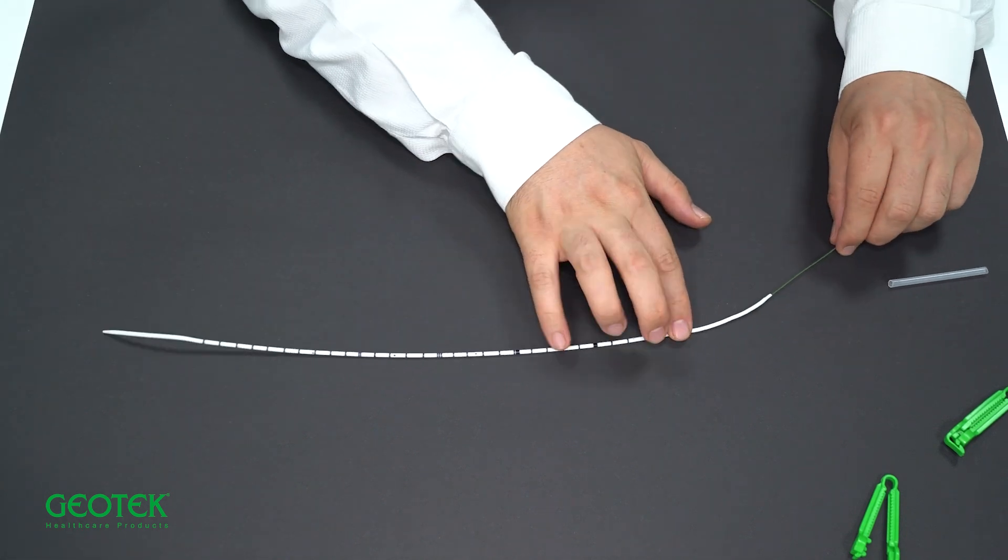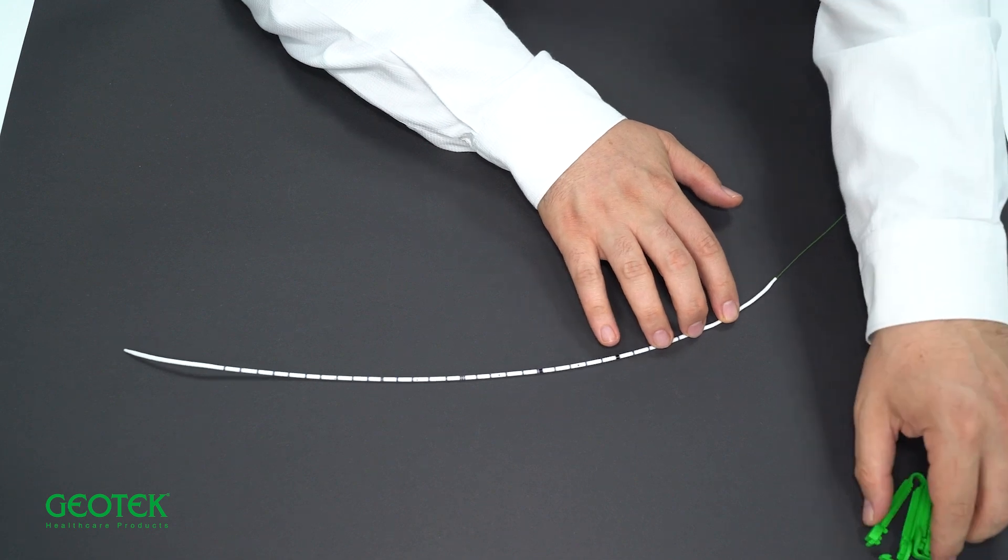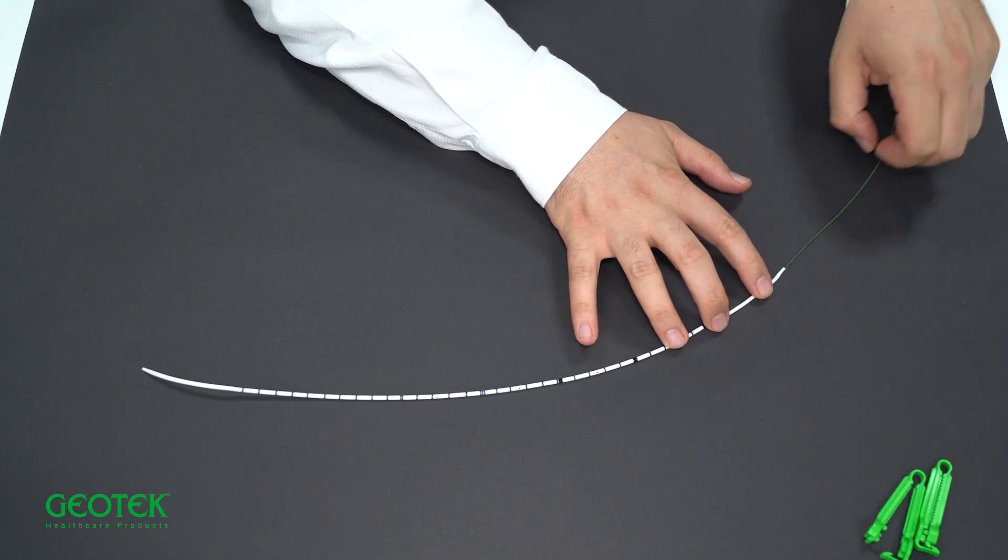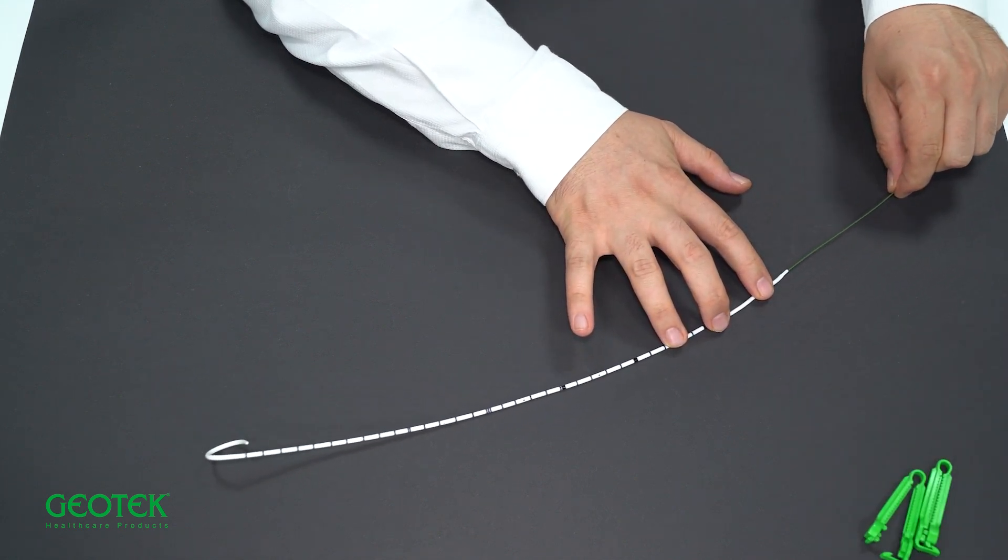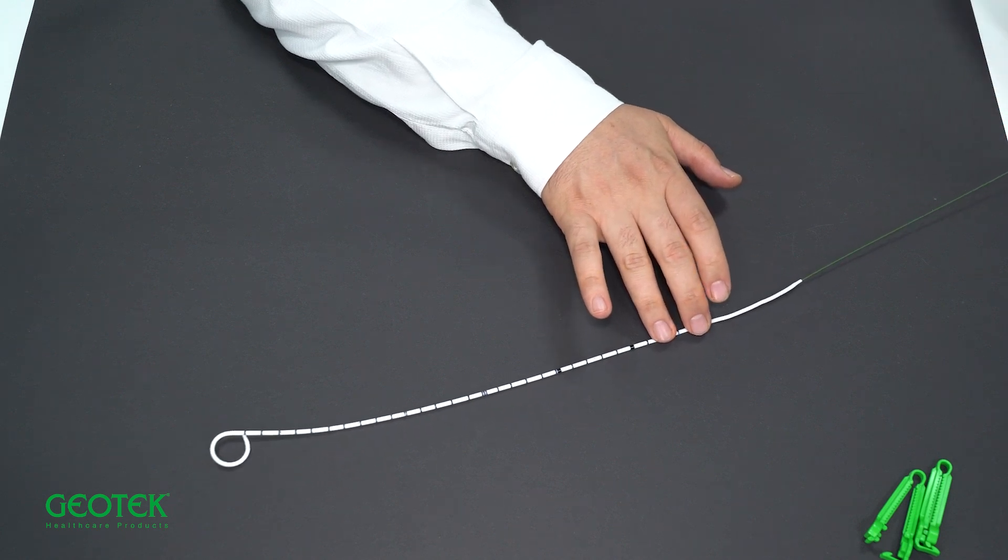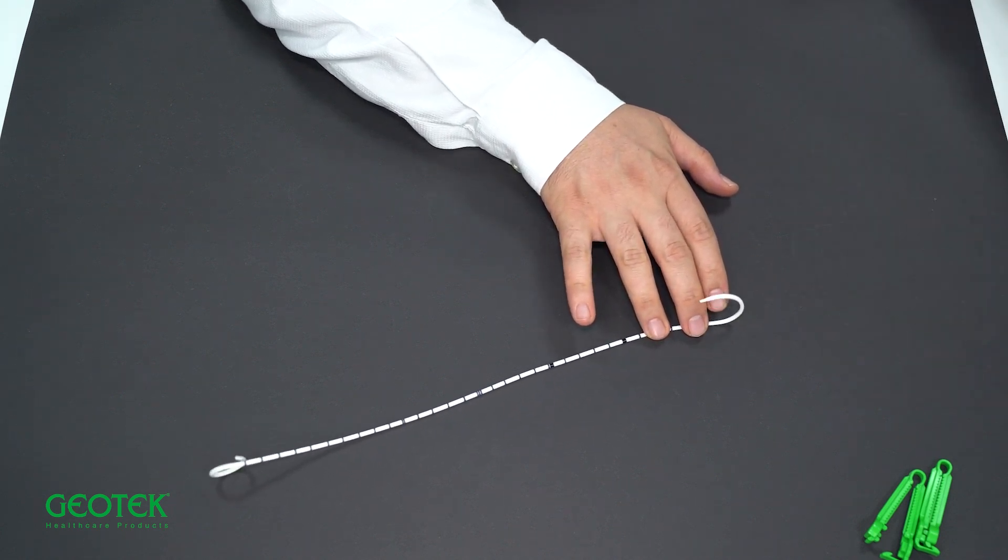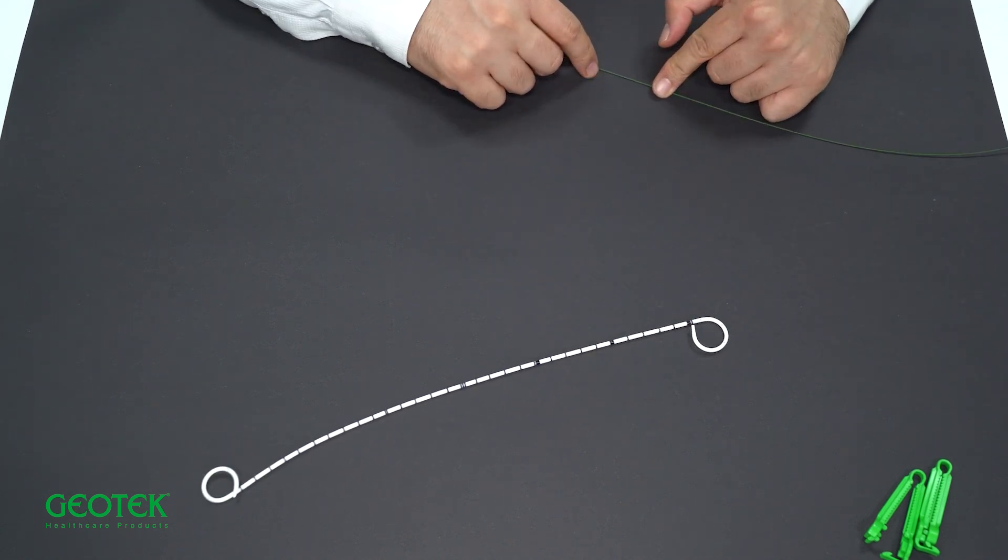When we successfully place our stent in the renal collecting system, as we see when we open the clip and pull the guidewire, it first bends in the kidney. Then, it bends in the bladder. The kidney tip and the bladder tip are thus positioned.